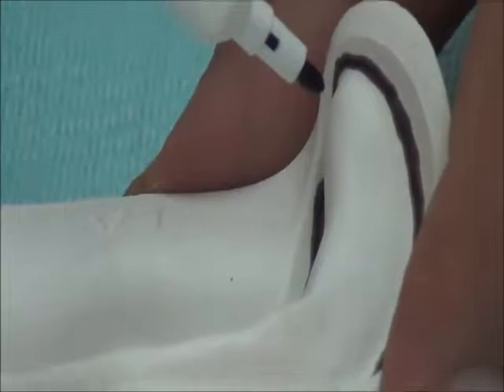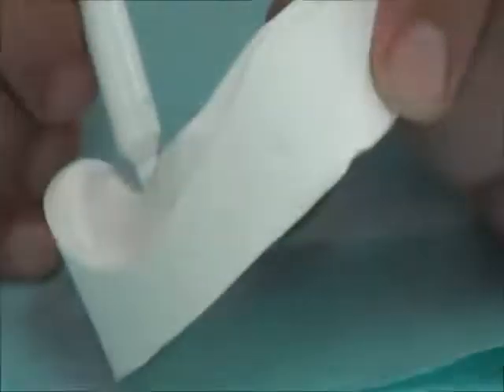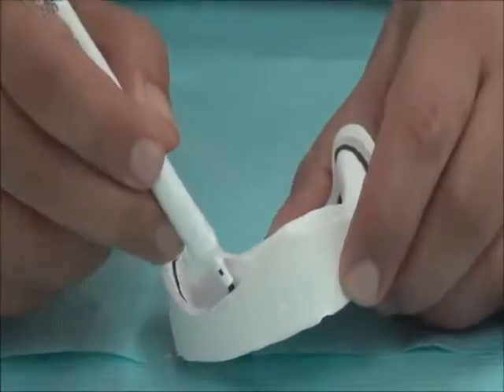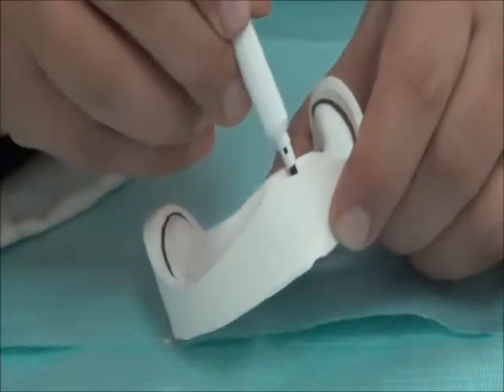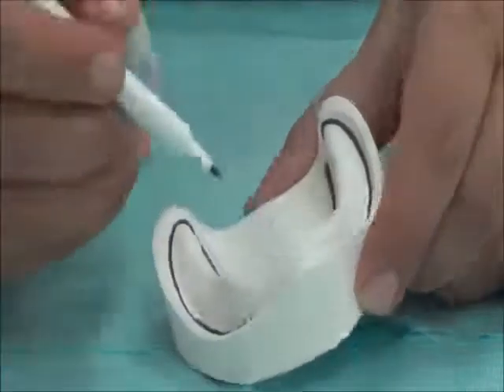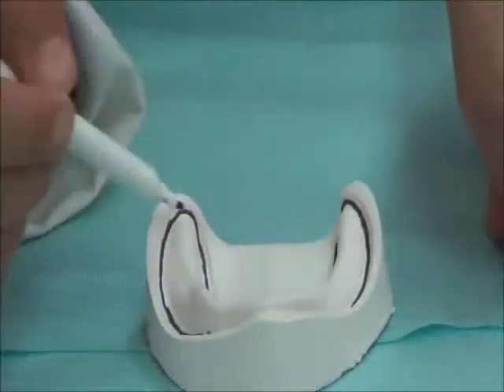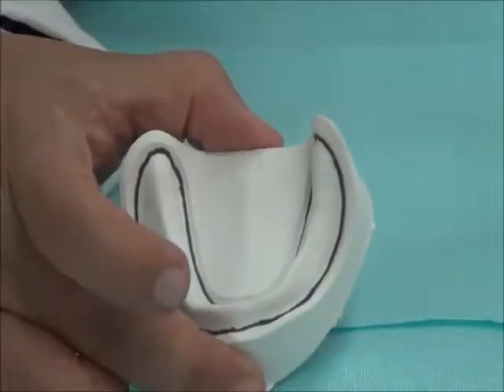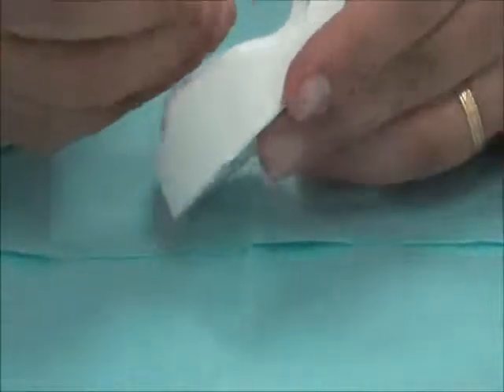But in the denture, not all of the retromolar pad is included in the denture base. But for the impression purpose, we need to record the whole retromolar pad because we want then to select the areas we need to include inside the denture. So the impression is a bit longer and more distant than the denture borders in the posterior areas. So this is the outline of the sulcus. This is not the outline of the tray. The tray should be 2 millimeters short and away from the tissue.